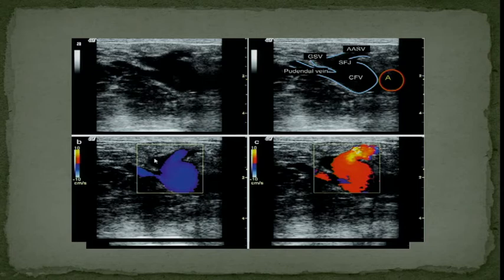Don't worry about this vein. It was just artifactual. Let's assume this is the great saphenous vein in this patient. If this is the great saphenous vein, is this normal? The tributary should be flowing into that vein. I don't know if that's lined up the appropriate way.